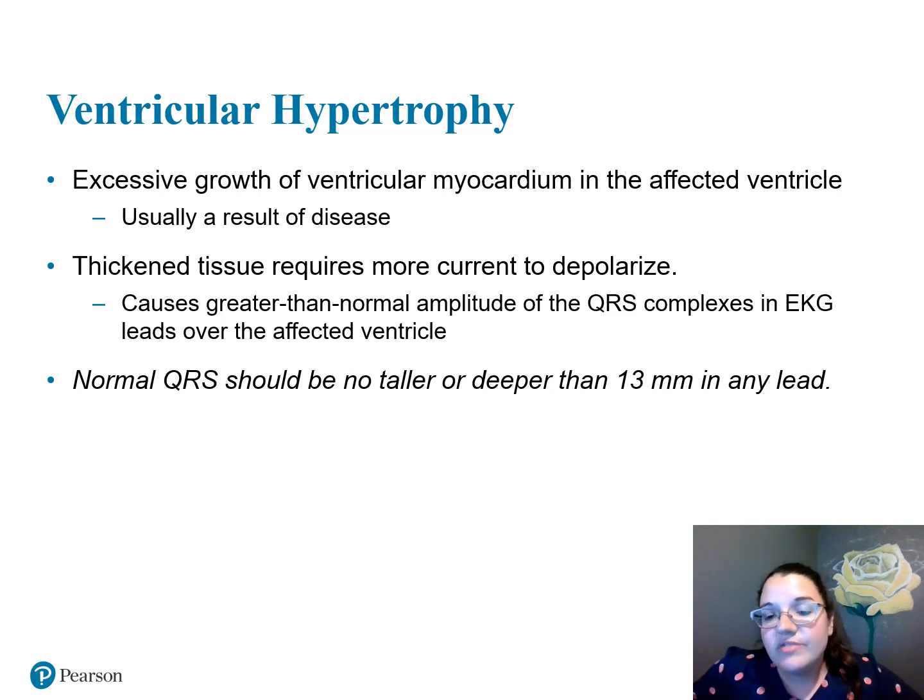It is usually a result of disease. Thickened tissue requires more current to depolarize and causes greater than normal amplitude of your QRS complexes in EKG leads over the affected ventricle. A normal QRS should be no taller than 13 mm in any lead.